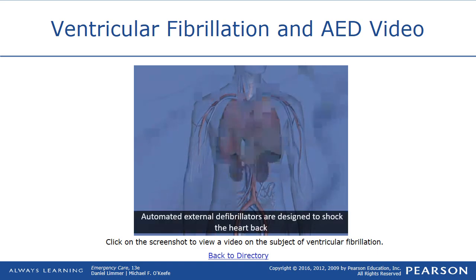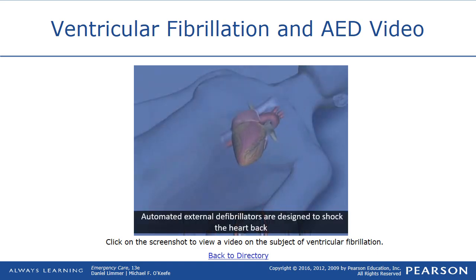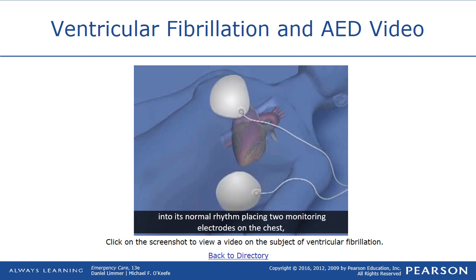Automated external defibrillators are designed to shock the heart back into its normal rhythm. Placing 2 monitoring electrodes on the chest, the AED measures the electrical activity of the heart, analyzes the cardiac rhythm, and determines whether a shock should be administered.